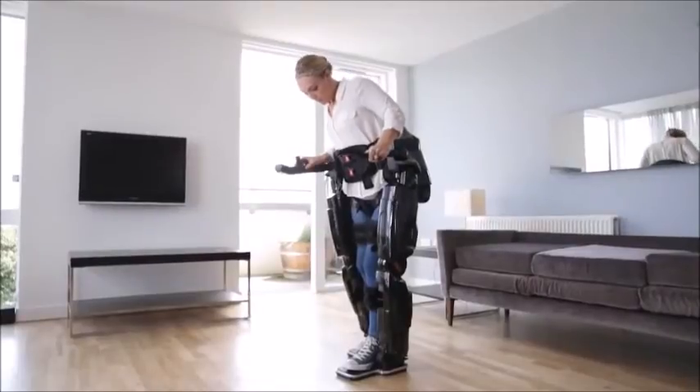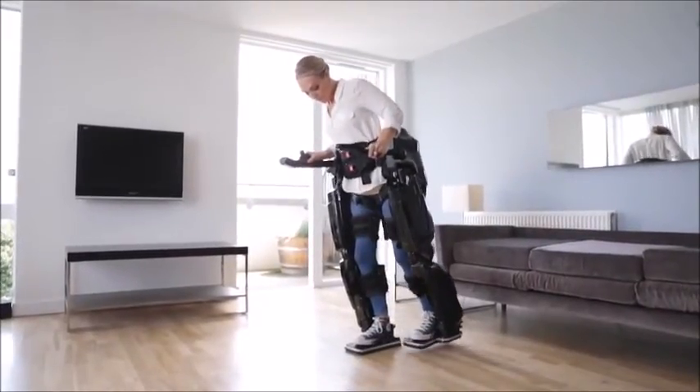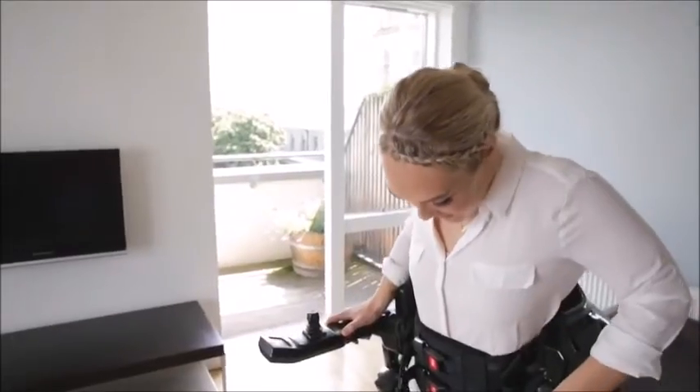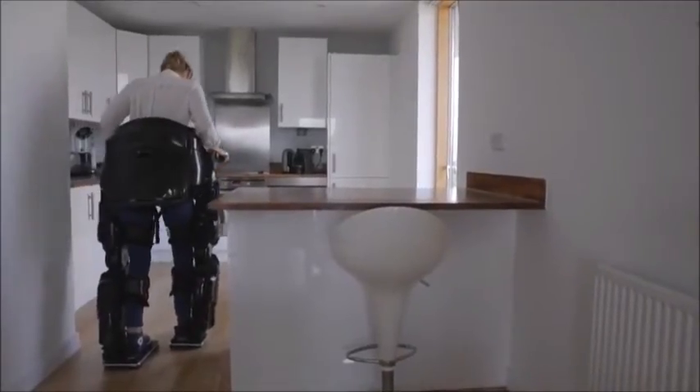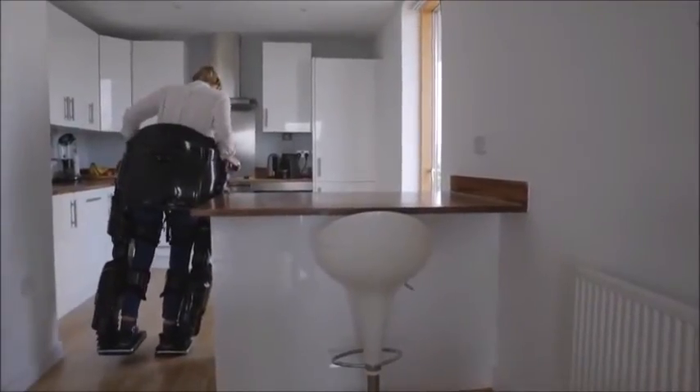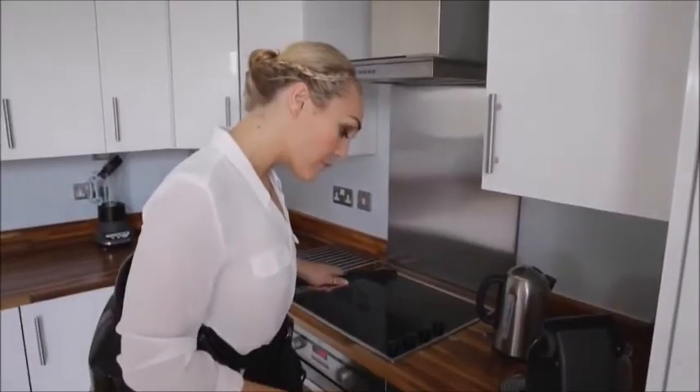Walking backwards is important as well because it allows me to stretch my hip flexors, which get tight over time from sitting in a wheelchair. Rex is the only exoskeleton that is capable of this function. Rex is also able to turn left and right. This can be done when stationary or on the move, and is useful for navigating smaller spaces that one might find in everyday life, such as in the office or at home.